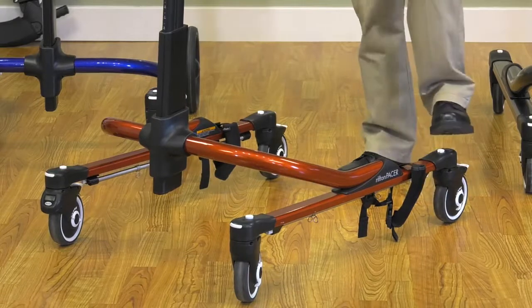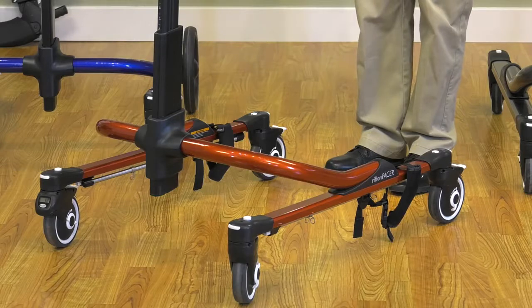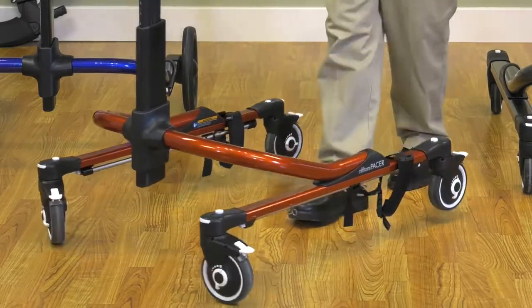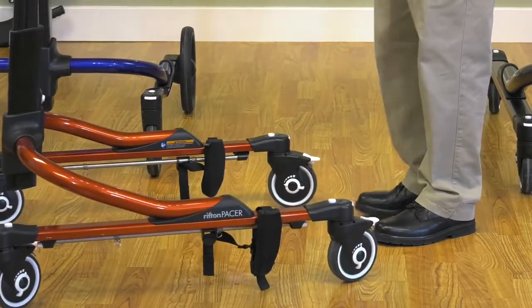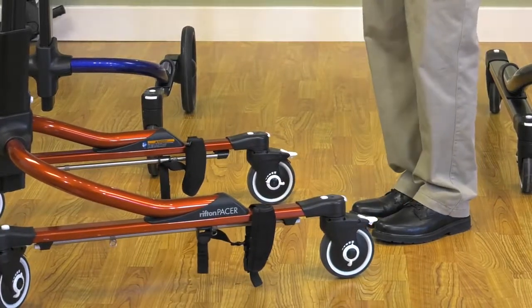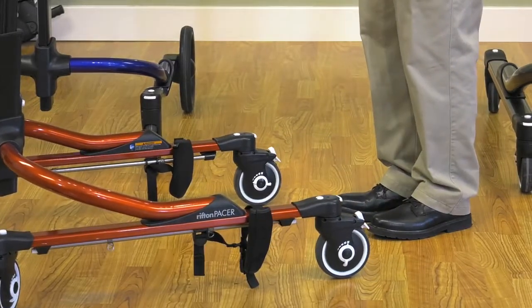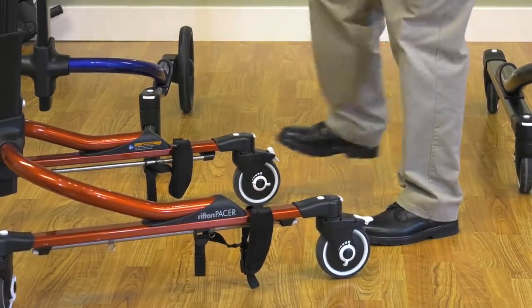You have the swivel lock that's easily activated by hitting the button on the top here, and then it's disengaged by just hitting that white tab right there at the back, and you've got your swivel on again. So that's the swivel lock. Then you have the brake, and you just turn that on by hitting the tab above the wheel and release by kicking it back like that.